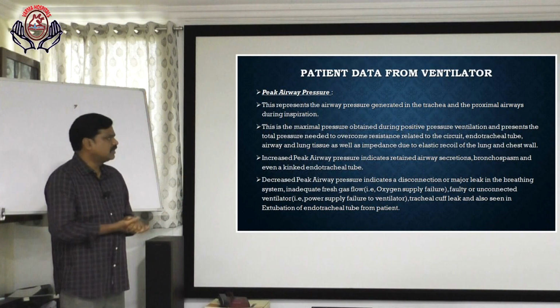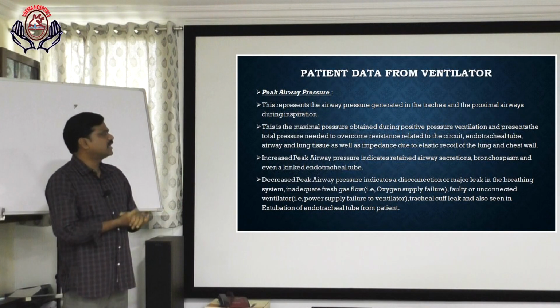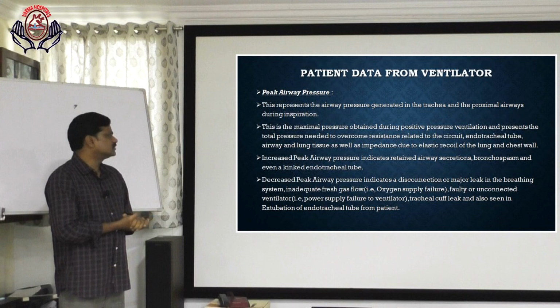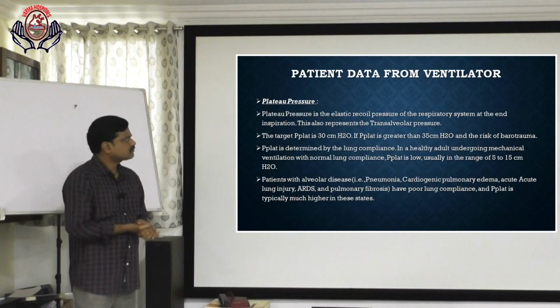Oxygen supply failure, a faulty or unconnected ventilator, power supply failure to the ventilator, tracheal cuff leak, and also seen with extubation of the endotracheal tube from the patient.